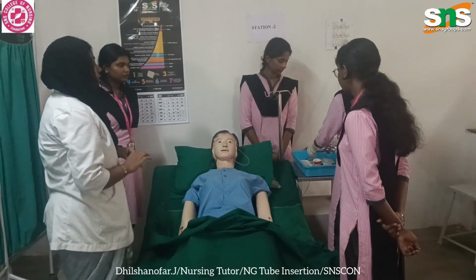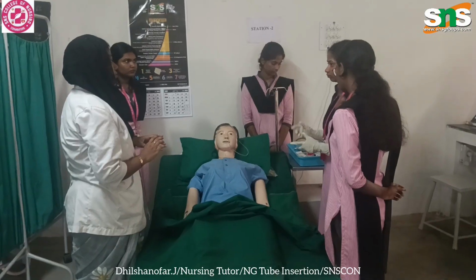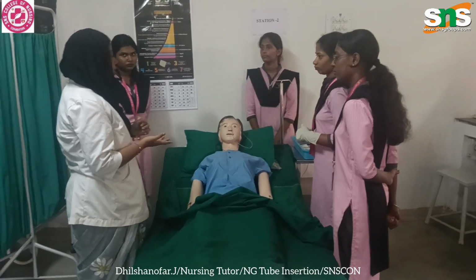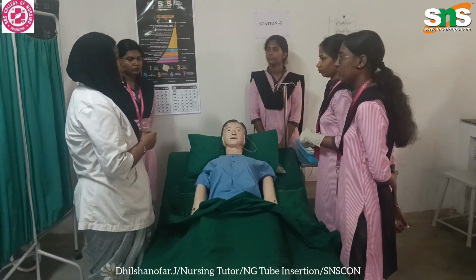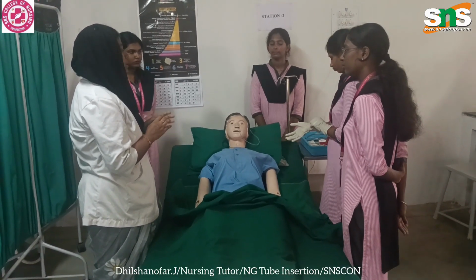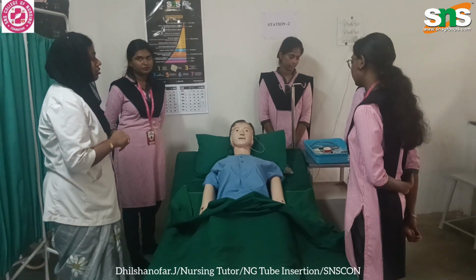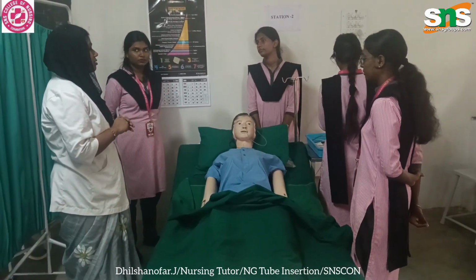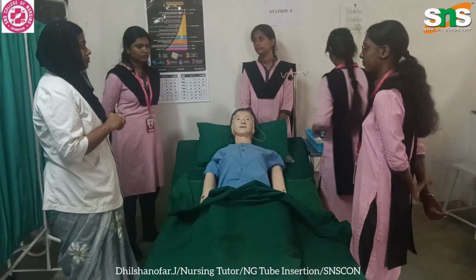Then what do you have to do? If any medication or feeding is there, you have to start the feeding. Then you have to remove your gloves and replace the articles. So this is the procedure of inserting a naso-gastric tube.